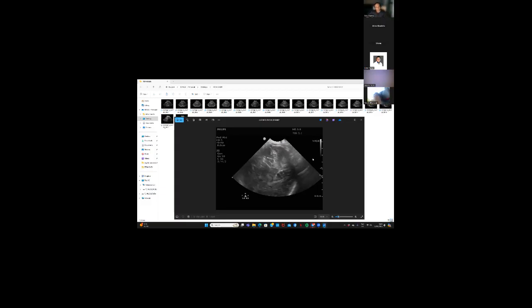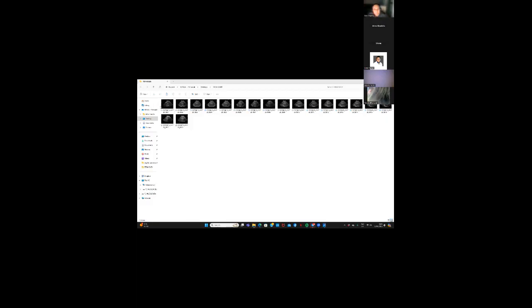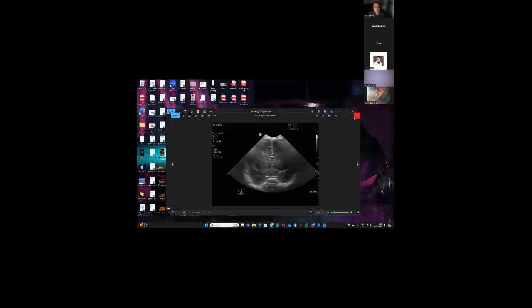This was another view I tried for the mastoid only. A little bit more difficult to delineate things over here. But the previous view was definitely better. And like I said, try to do the mastoids separately if you're finding that you're not able to get the opposite hemisphere. Sure, I will do that. A follow-up scan in about a week would be nice. Yeah, I will follow it up.